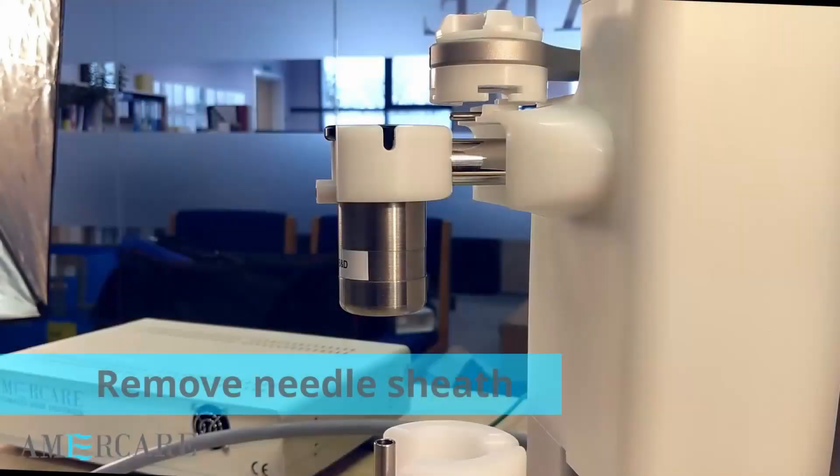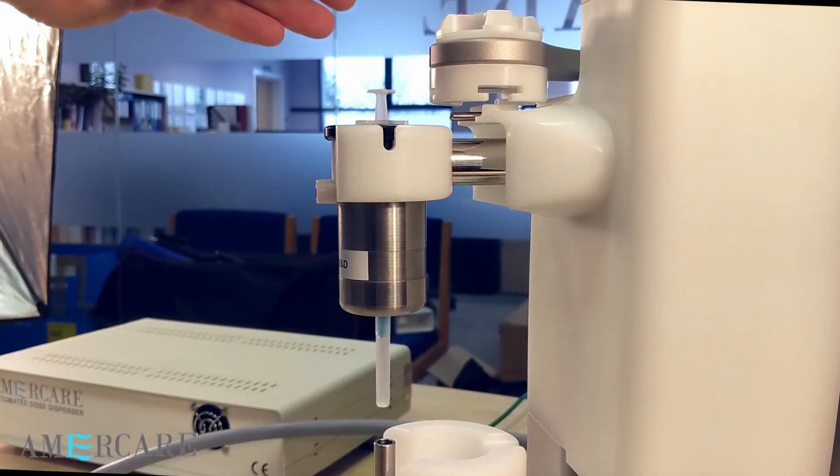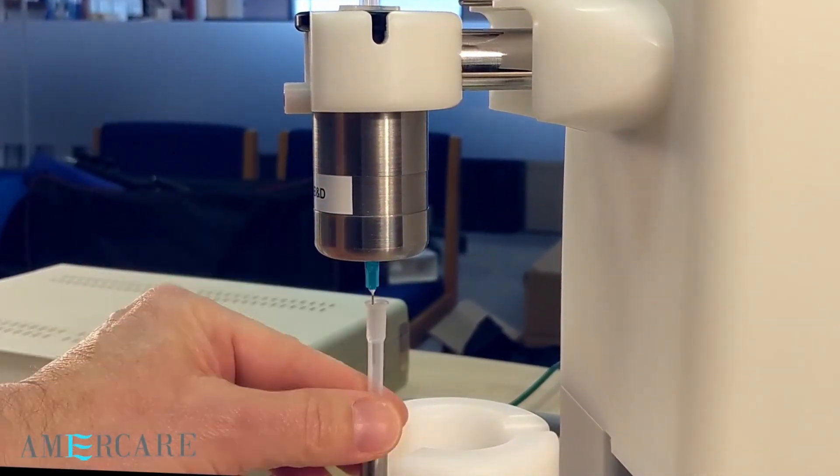The first thing to do when loading the syringe is to remove the sheath. Simply drop the syringe into the shield and pull the sheath down into the holder.